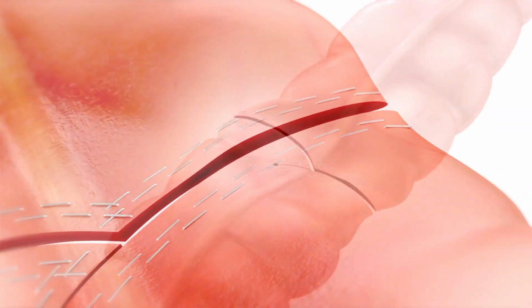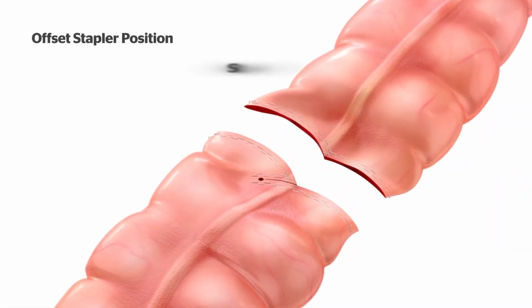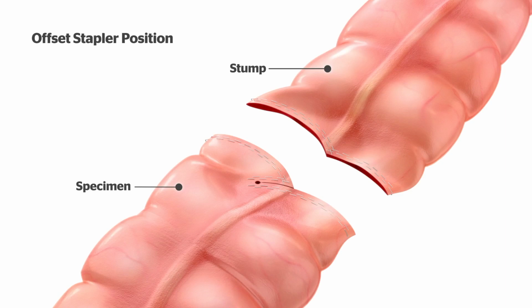When the second firing is offset, the pinhole and any overcut from the second transection will be removed with the specimen. When the second firing is aligned to the first, the device creates a continuous seal and transection from the retaining pinhole.